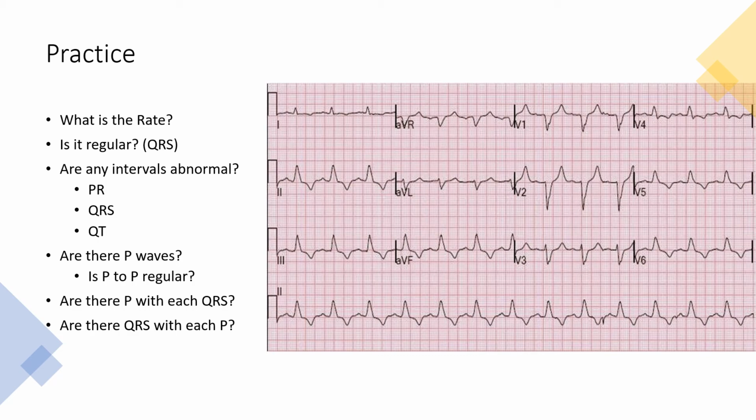So the atria are depolarizing the ventricles, from what is apparent. The P waves appear regularly dispersed, and so do the QRSs. So why do we have a long QRS? Potentially from ectopic pacemakers, sodium channel blockade, or bundle branch blocks.